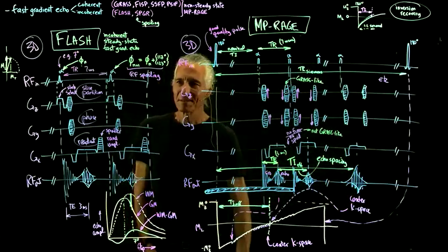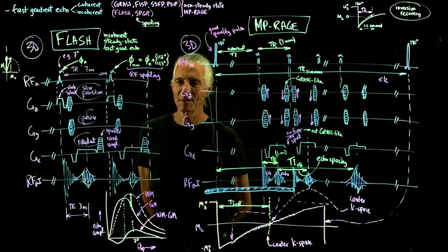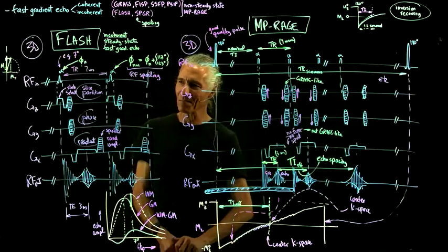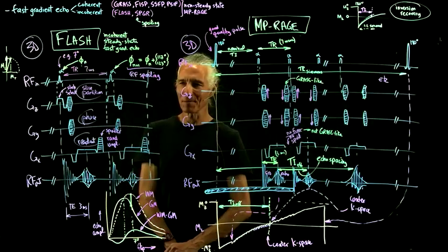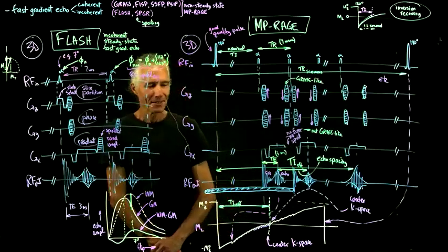Okay, so any questions about this sort of conceptual development of these sequences? So on Friday, I'll talk about MP2RAGE, because there's a MP2RAGE. We have that one on the scanner too. It's a useful one. Okay.